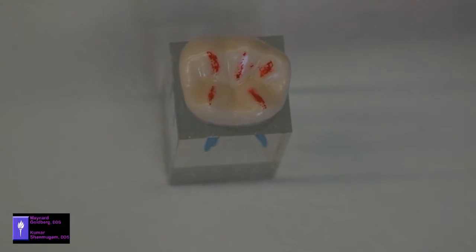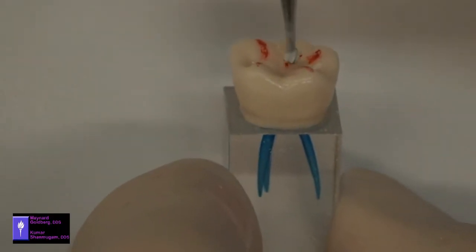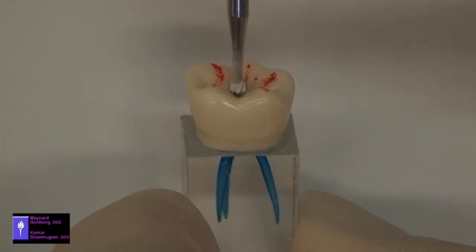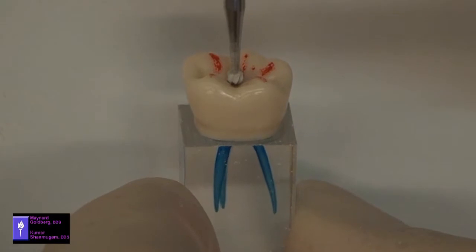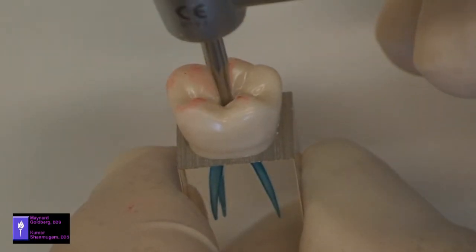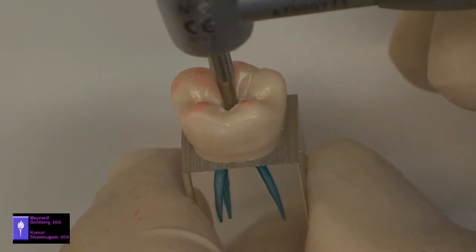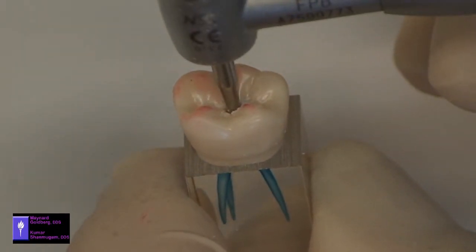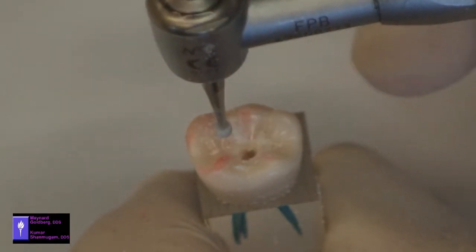For maxillary and mandibular molars, the principle for gaining access is the same as for any other tooth. The burr is held in the long axis of the tooth in a vertical direction in the central fossa, as one can see here. If done correctly, the burr will be at right angles to the occlusal surface. And there we are, we dropped in. Now we're going to place the burr just below that penetration and bring it up to the occlusal height of the occlusal surface, holding it in the vertical direction, that is in the long axis of the tooth.